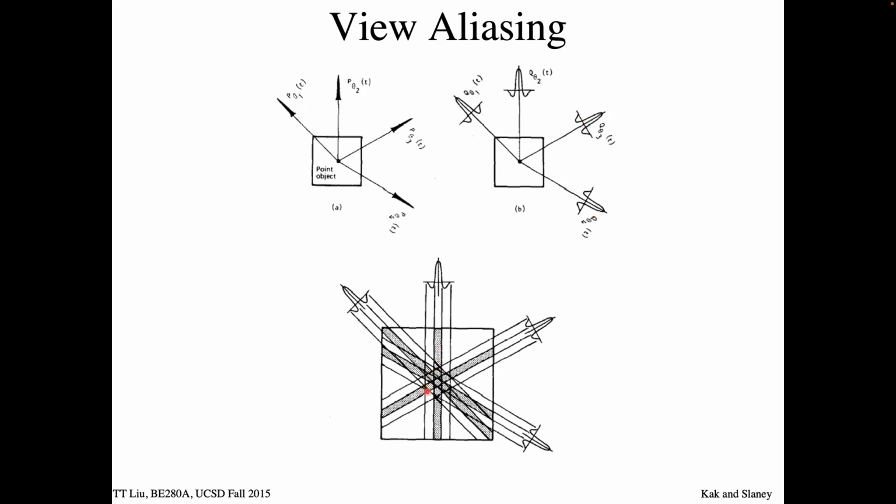Well, you can see there's a high density of estimates where they all overlap, right? There is a field of view inside which they're all overlapping. And you can imagine that as I add projections, the core field of view in the middle will grow out, as I can add more projections, right?